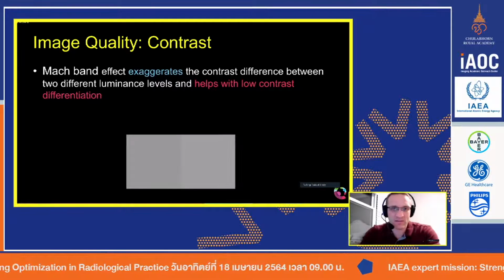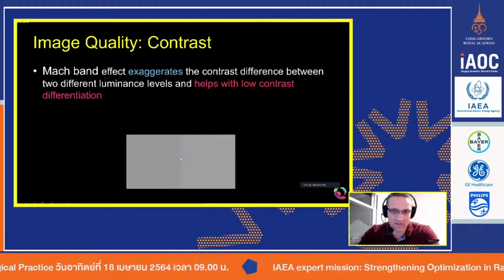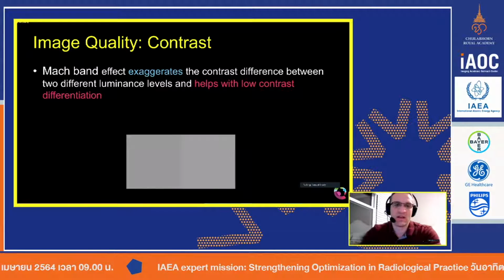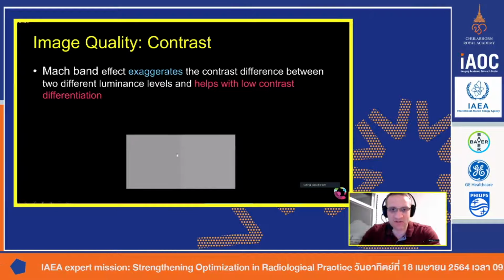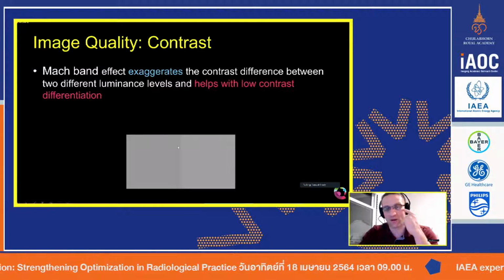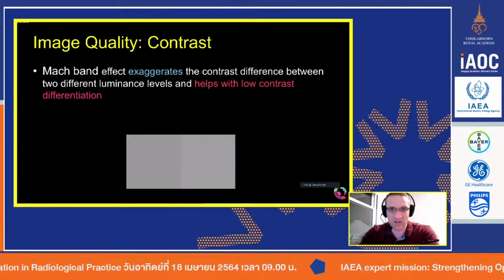And this distinction, this strong edge effect that you see here, whereas you didn't see it a minute ago when they were separated, is based on this Mach band effect. It simply exaggerates edges, and this is what really helps our eyes or our brains perceive contrast. It's the edge.